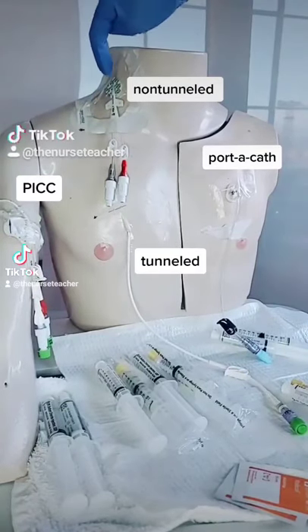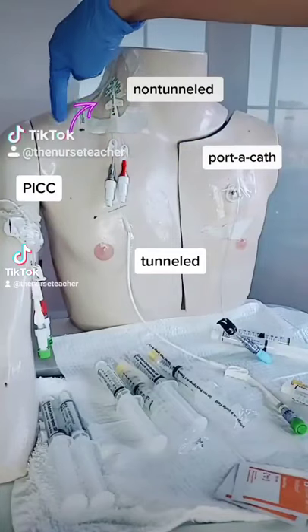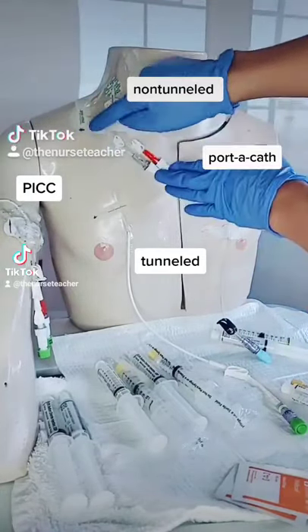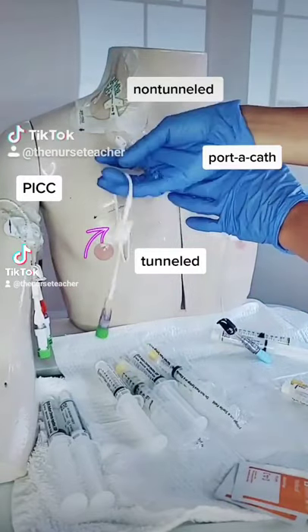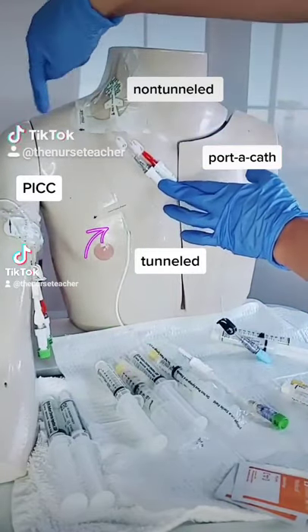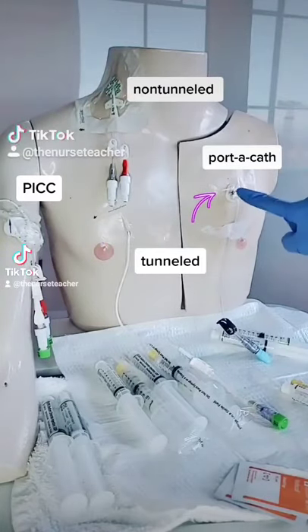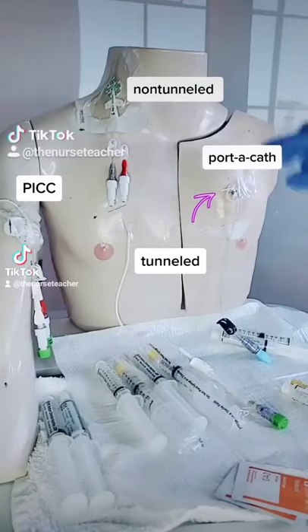Here are the four main types of central lines. The first one is non-tunneled — it goes into the IJ or subclavian vein, and this one is a double lumen. The second is a tunneled line; it is tunneled underneath the skin and into the IJ or subclavian vein. The third is a portacath or IVAD, which needs to be accessed and de-accessed.